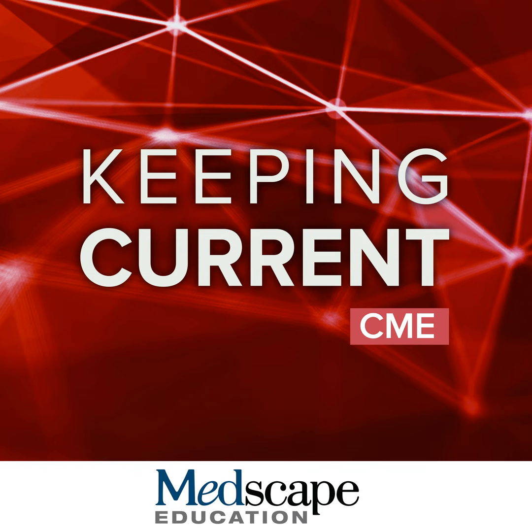And I do recommend here, you can see in the footnote, there is a consensus appropriate use recommendation that was published last year. So, first of all, both of these are a pretty good choice if the patient is suspected to have Alzheimer's disease. Both of these should be positive for a patient with impairment and a clinical suspicion for Alzheimer's. And that's true, really, regardless of age. Now, what about if there are some atypical features? Yes, they would also, for Alzheimer's disease, still be positive, even if some of the features were inconclusive.